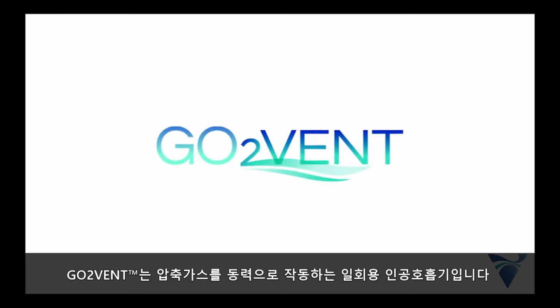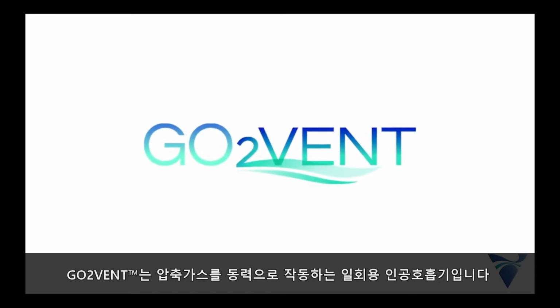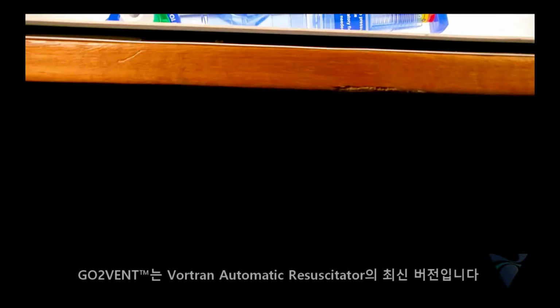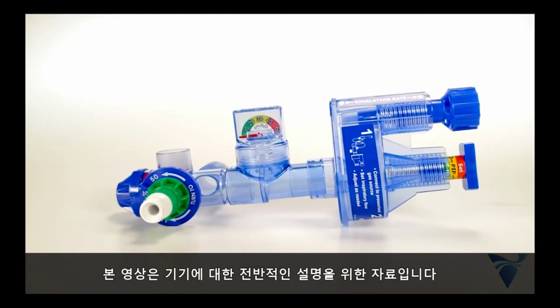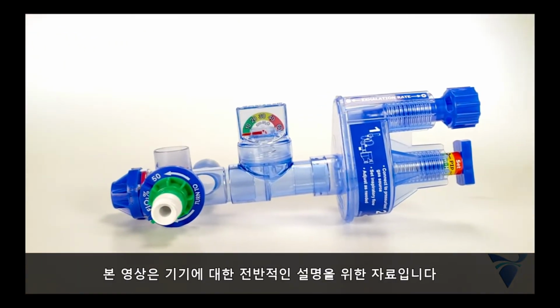VORTRAN presents the GO2VENT, an automatic gas-powered ventilator. The GO2VENT is the latest version of the VORTRAN automatic resuscitator. This video will show an overview of the device.